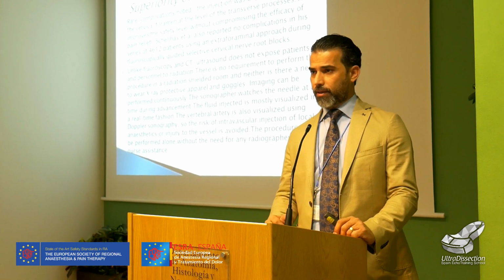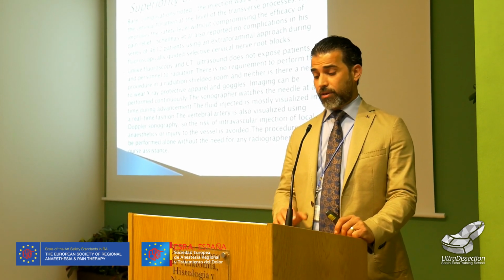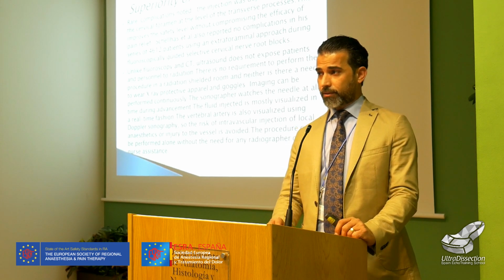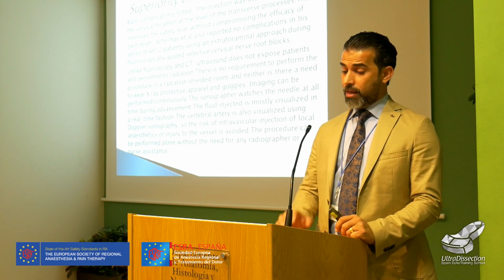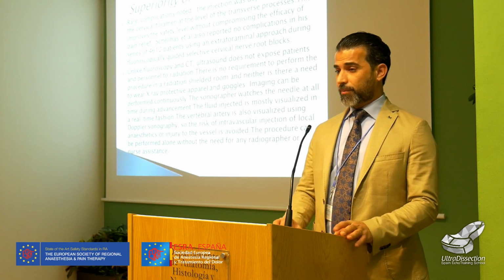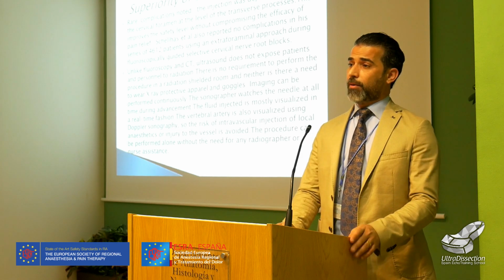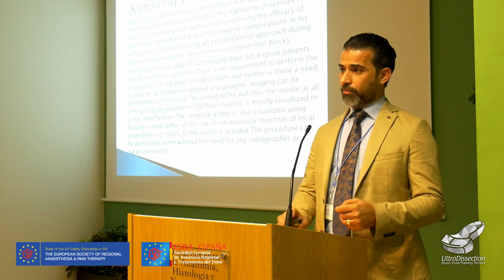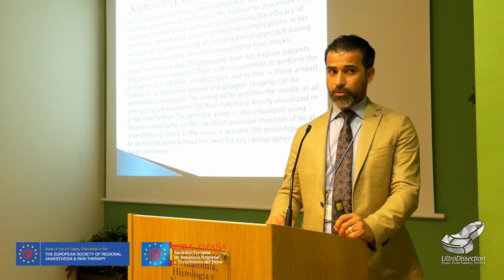It is superior to transforaminal injection, where you put the needle inside the foramina. Here you are away from the radicular artery, the vertebral artery, and the spinal cord, and this is the superiority of ultrasound. By CT scan or fluoroscope, it is so difficult to find the existing foramina or existing root. You need to inject dye, and you need a lot of exposure to reach this level and then continue your procedure.